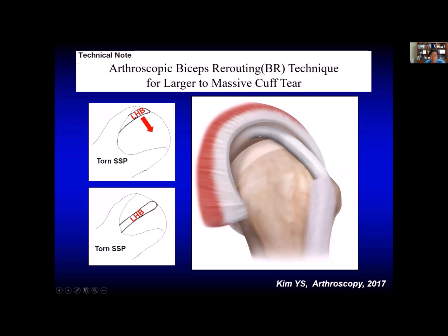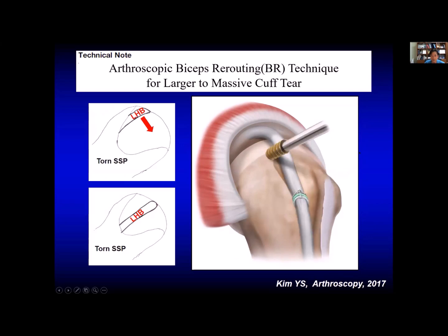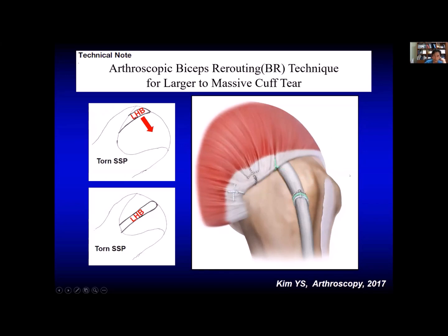It's the second step. So this is a kind of picture that I made. The soft tissue is released from the biceps groove as a first step, which lets the biceps move freely, and then a new groove is made in the middle of the cuff footprint. Then using the lateral anchor and the medial anchor, the rerouted biceps is fixed with the suture, and an additional suture anchor is inserted to the posterior lateral corner, and the torn cuff tendon is repaired to finish the operation.